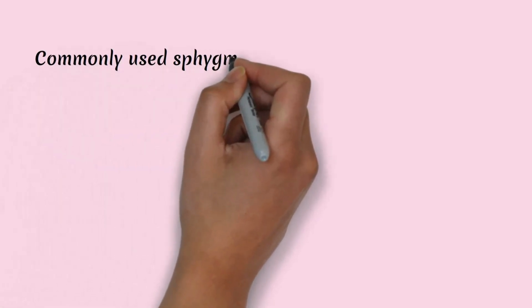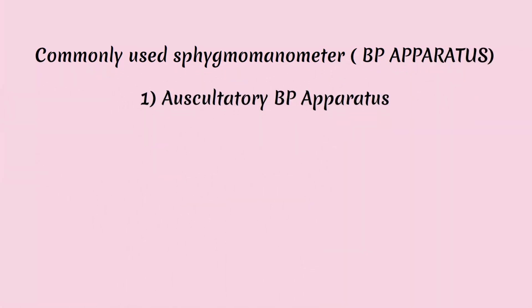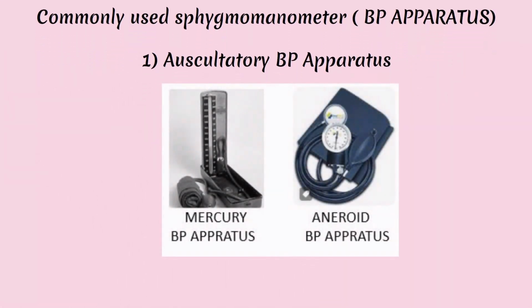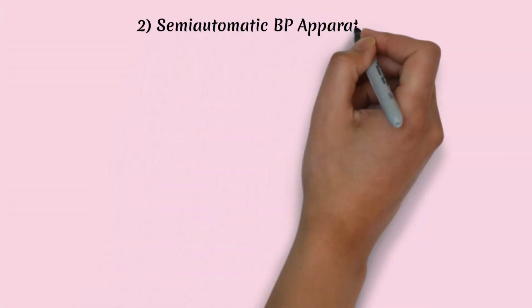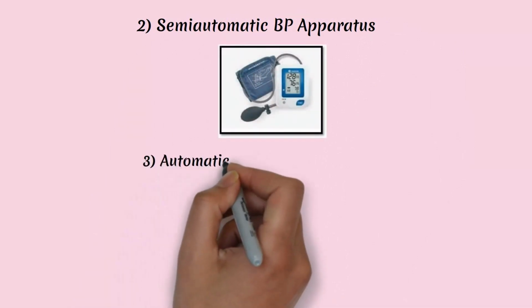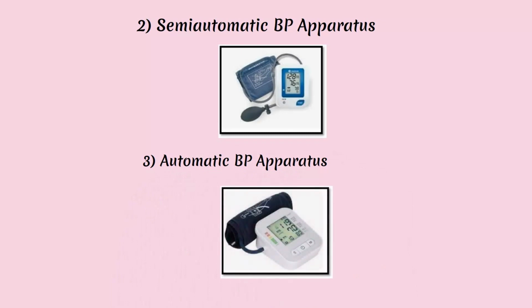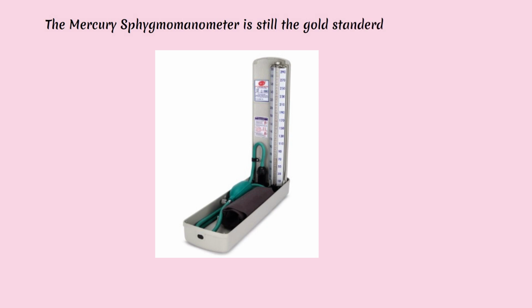Commonly used BP apparatus: sphygmomanometer, auscultatory BP apparatus, semi-automatic BP apparatus, and automatic BP apparatus. The mercury sphygmomanometer is still the gold standard for measurement.